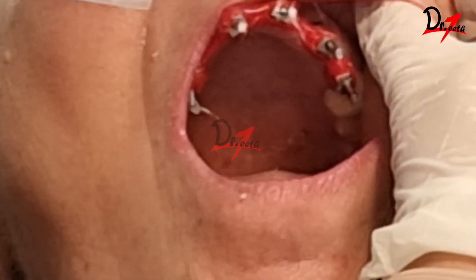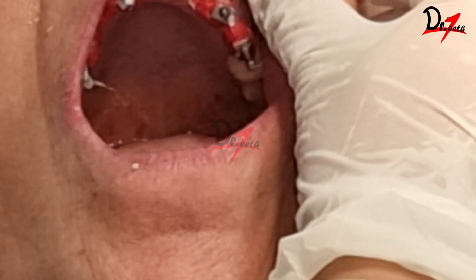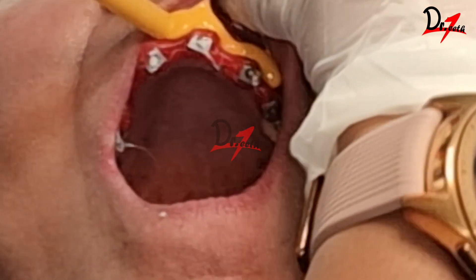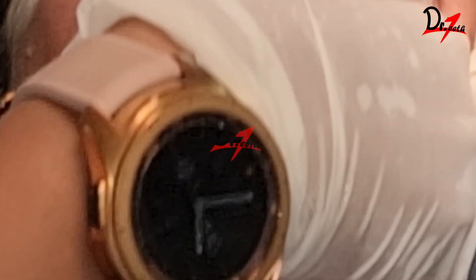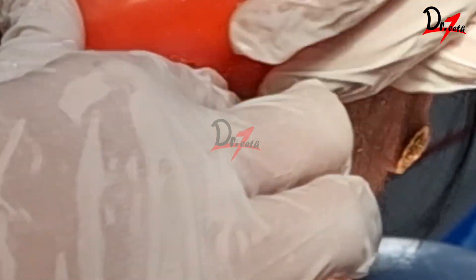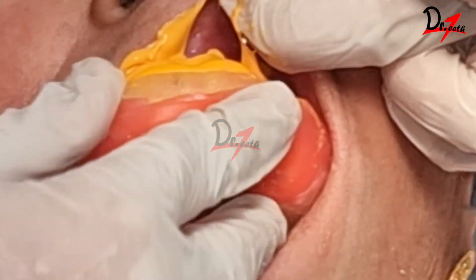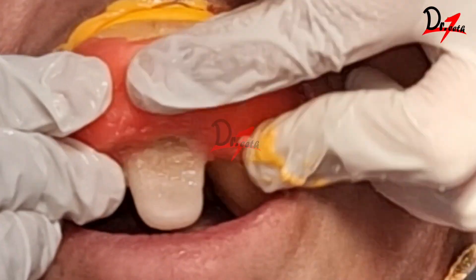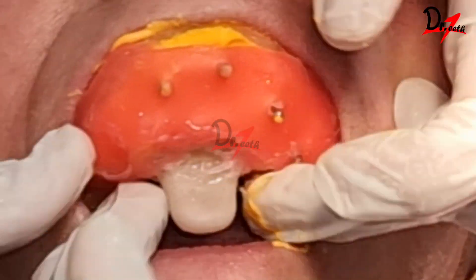For the impression procedure, monophase materials are suitable. However, in our case we are using light body addition silicone and putty. First, light body is injected as you can see here, and then we use the putty material to make the impression. You will notice that the openings we had made in the tray have been blocked with modeling wax. This is done to give some stability to the material inside — especially if you're using a monophase material, this is a must.